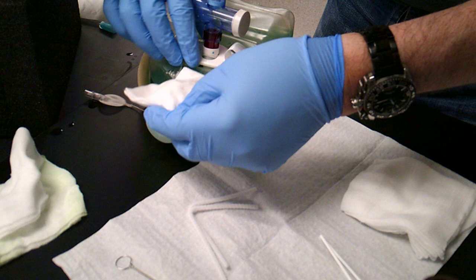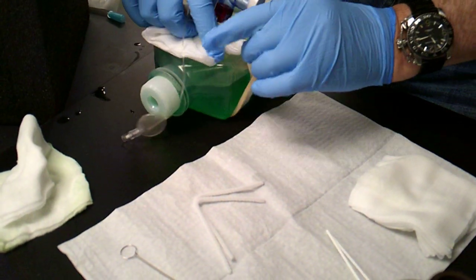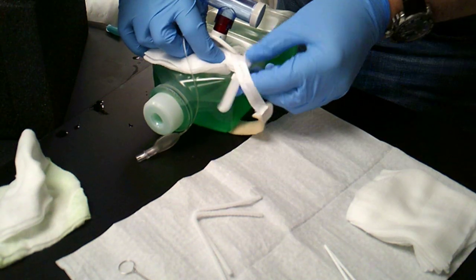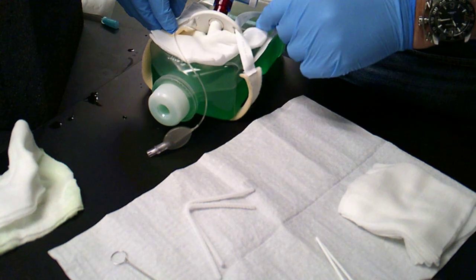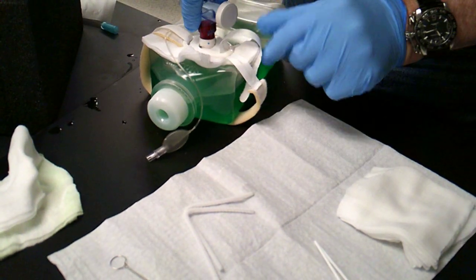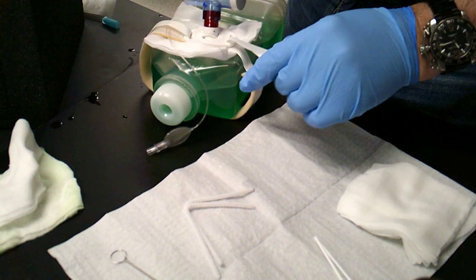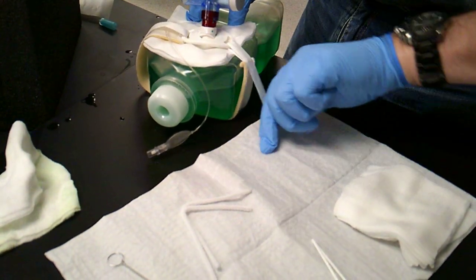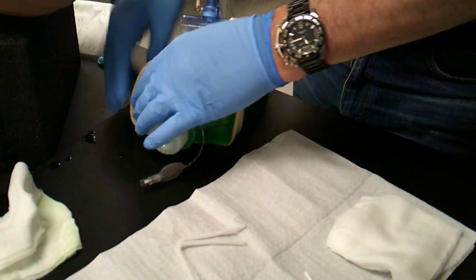We can go ahead then and put our dressing on. And we would get a new set of trach ties. And we would go ahead and have the trach ties changed out also. And then these are just secured on the back of the patient.